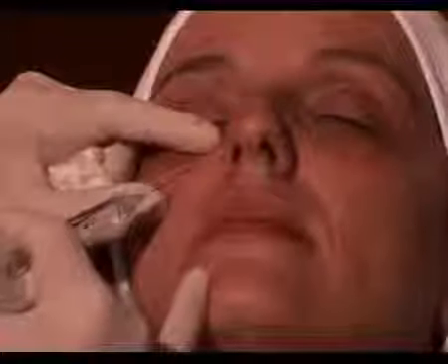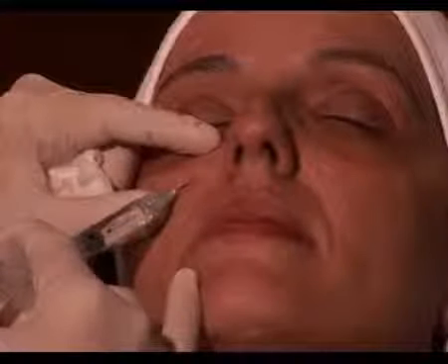I know a lot of people like to draw. They like to tell you that, oh, you have to inject here, don't inject over there. It's very important to know that wherever you see your defect, I like to make things as simple as possible. Wherever you see your defect, that's the area that you want to inject. Now, I'm going to be injecting right here in the center. There are no major structures that are found here. Go in and inject a little bit of a bolus.